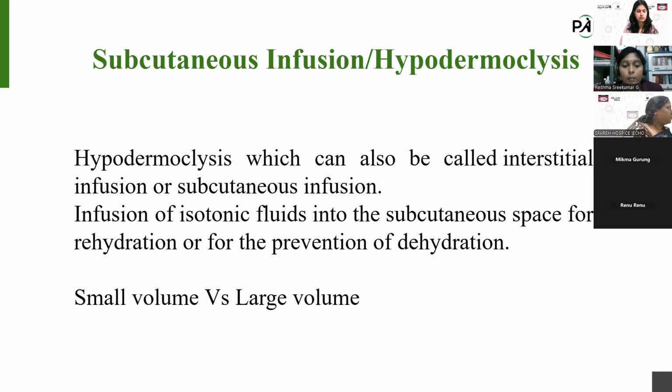About small volume versus large volume: unlike intravenous fluid administration, we cannot administer large volumes in subcutaneous infusions.